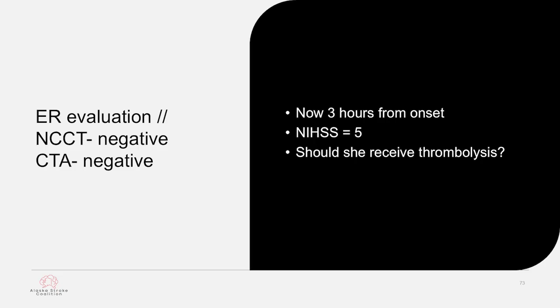So when we're looking at these patients, as far as lytic, there's 3 things I always tell folks to at least think of as a checklist. Number 1, is this a stroke? That aspect has to be decided on. If you believe it's a stroke, then you have to determine whether that is a patient who's a candidate for thrombolysis. And third, whether they are or not a candidate for thrombolysis, you have to determine whether they're a candidate for thrombectomy.